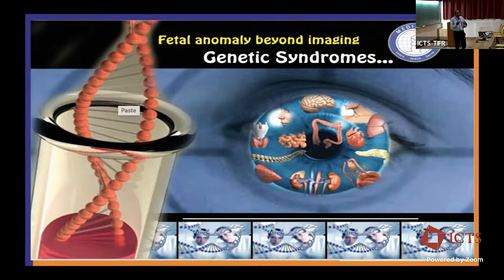Now, in a fetus, I diagnose different anomalies. All I want to ask is, can all these have a common cause? Let's say if there is an absent nasal bone, tricuspid regurgitation, and increased nuchal translucency, all this points toward Down syndrome.